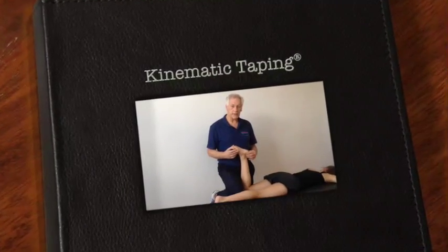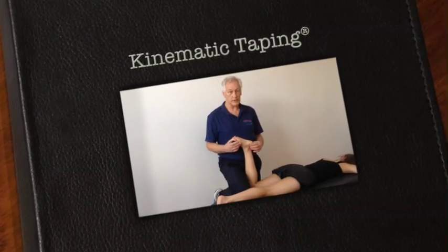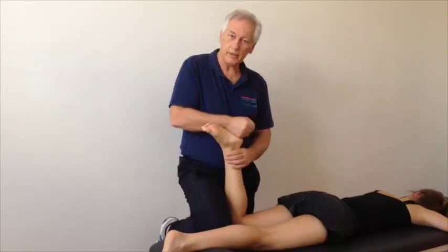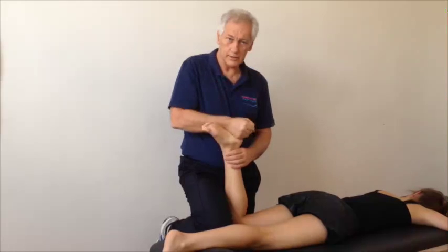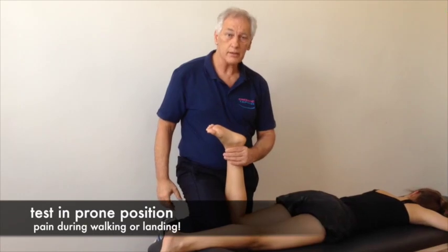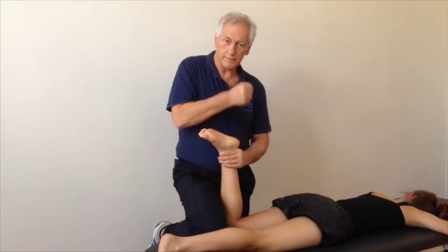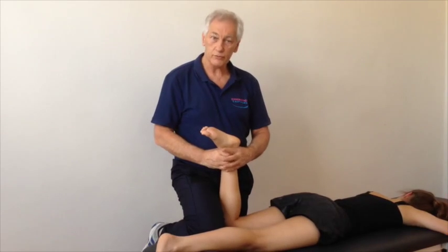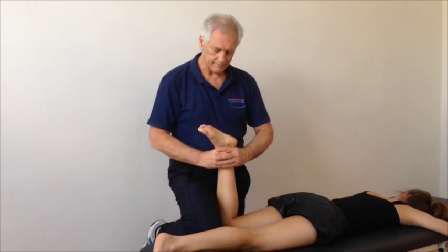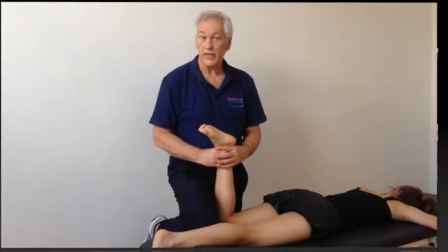A special type of ankle sprain is the so-called high ankle sprain, which is a syndesmosis injury lesion. Typically presenting with pain on landing, which you can simulate by slamming on the heel. If you compress the lower leg — the tibia and fibula at the malleolar line — the pain may be less. This is an indication for taping, giving compression stimulation for quicker, better, and more stable healing of the syndesmosis over some weeks.